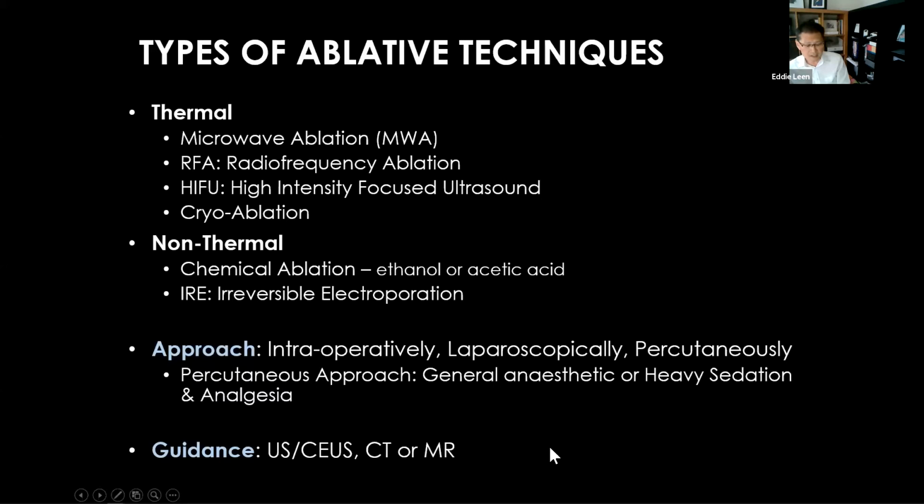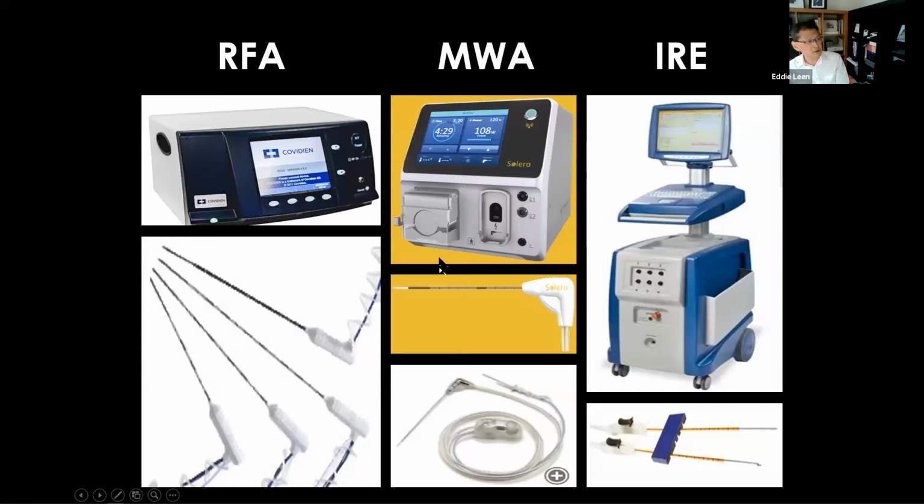This slide here illustrates the three modalities that I'm going to talk about, RFA, microwave, and IRE. The generators are seen at the top end of the slides, and the various needle sizes and techniques that we use for the different types of tumors.